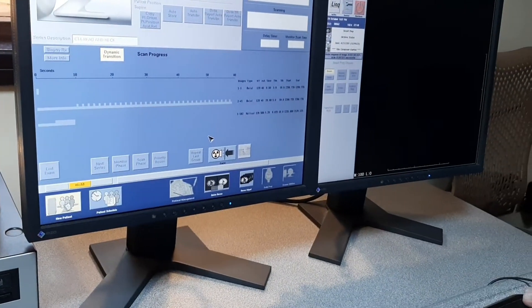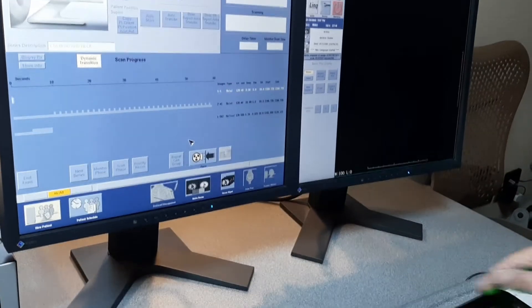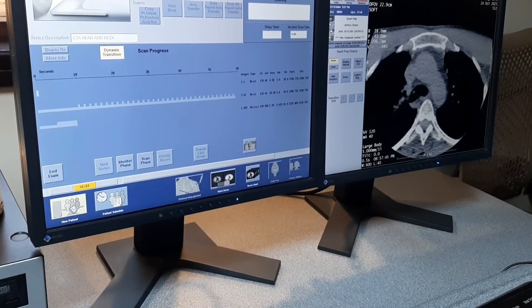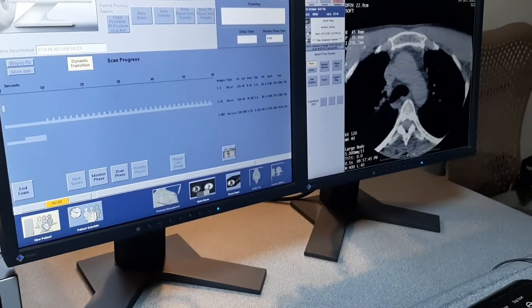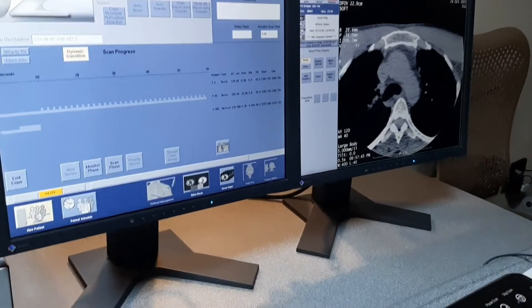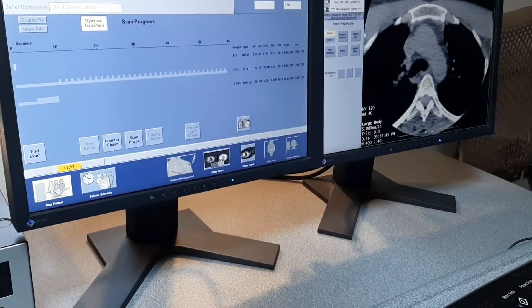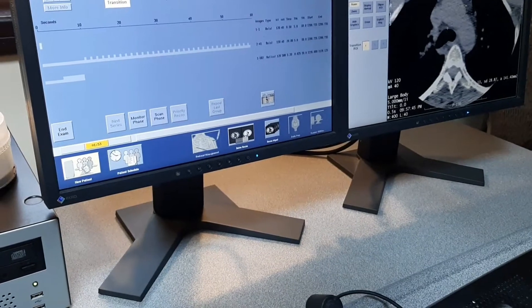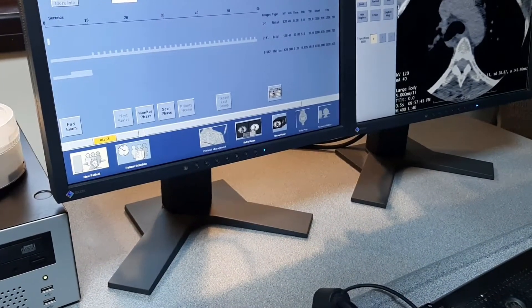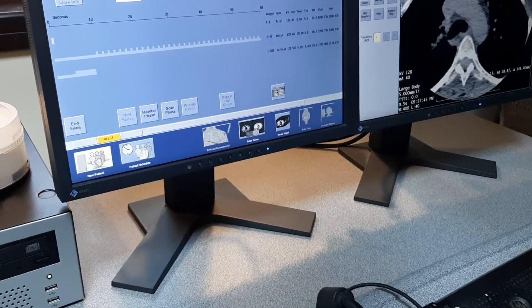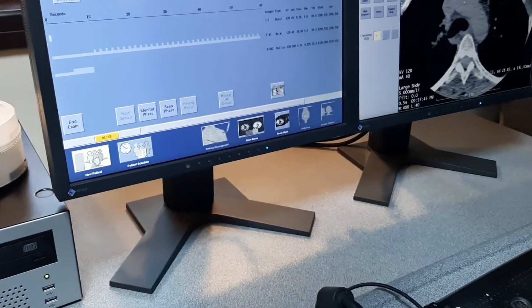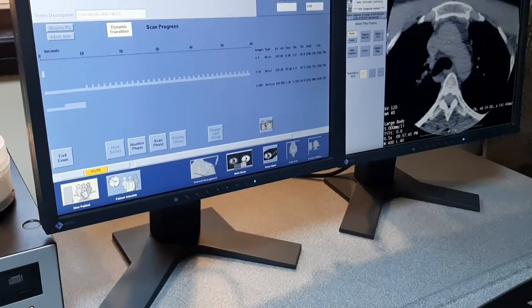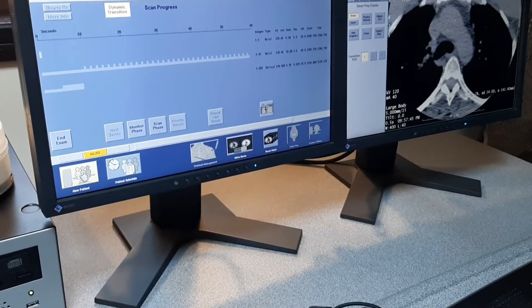Take the reference. Yes, it's fine. Now you can see the reference. Put the reference — the ellipse ROI — on the other side. Yes, now put it here in the center of the aortic arch. Don't remove it, just move it. Yes, that's right. Now proceed to the monitor phase.